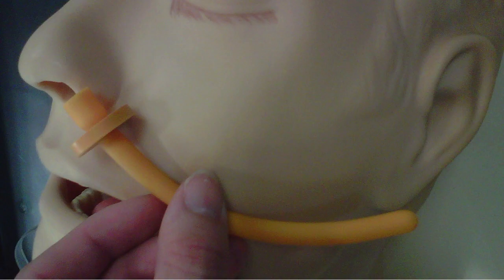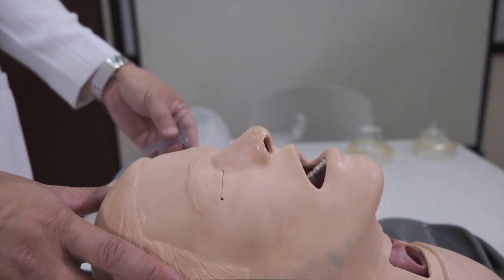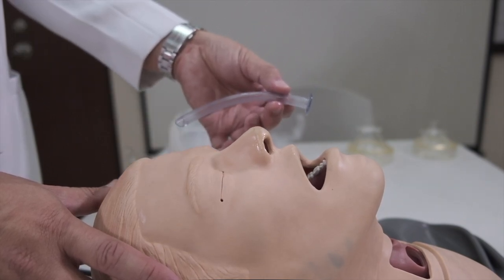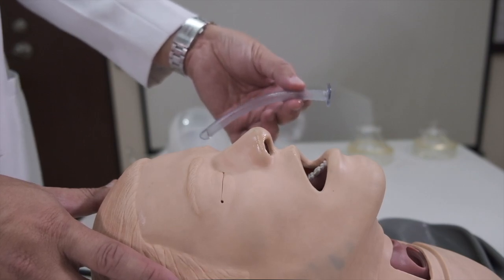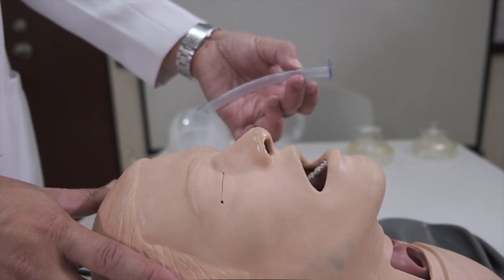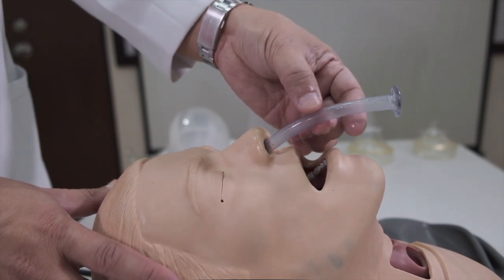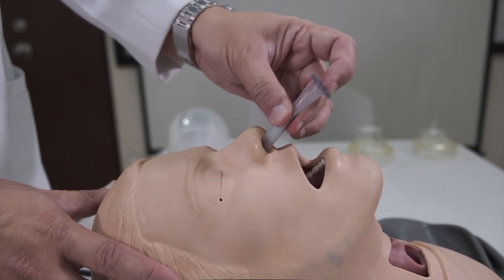So now we proceed with the actual demonstration of insertion. So I'm going to demonstrate the proper way of inserting a nasopharyngeal airway. So you need an appropriately sized nasal airway. Lubricate with KY jelly. Take note of the curve. Follow the curve of the nasal airway and gently insert it into the patient's nose.